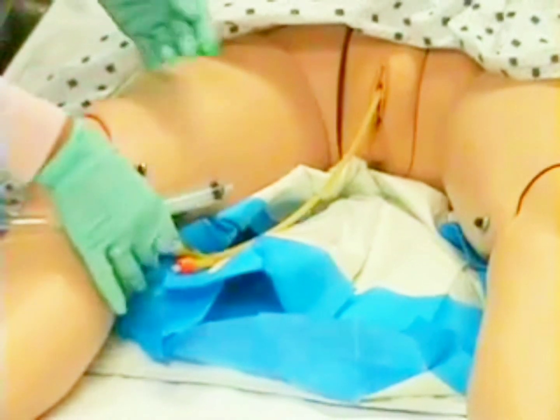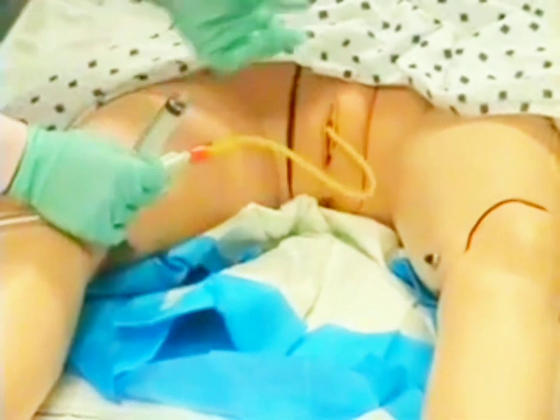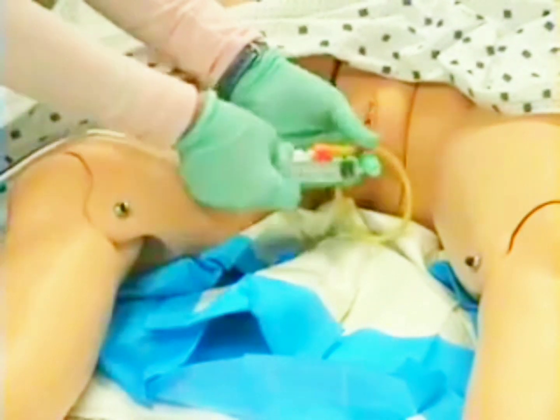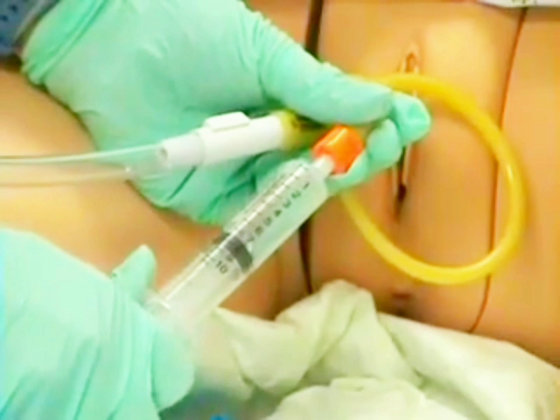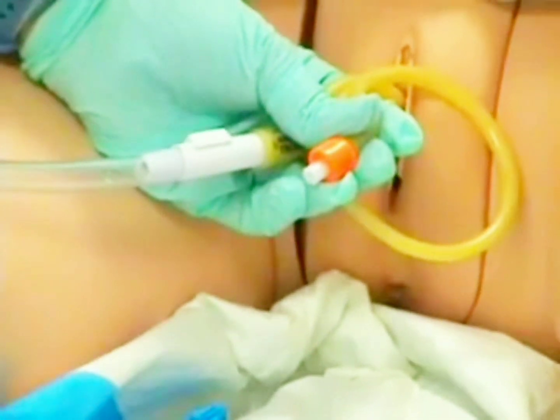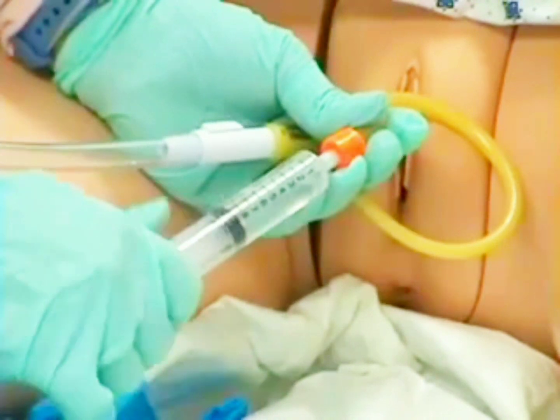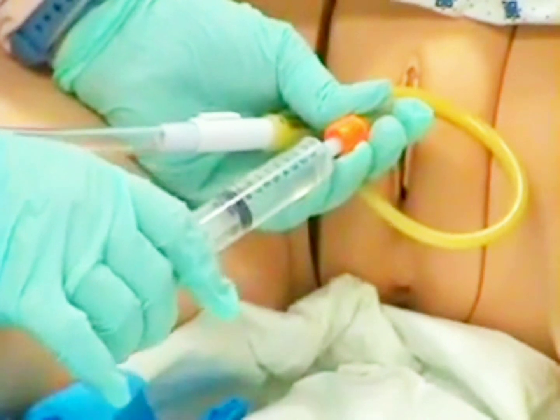I'm now going to deflate the balloon on my Foley catheter. I have my 10 ml syringe and I will attach it to the balloon port of my catheter. With my other hand, I will securely hold my catheter so that when I deflate the balloon, the catheter does not pop out and splatter urine. With a twisting motion, I attach my syringe and it fills with the sterile water. Once it has reached the 10 ml mark, I will remove my syringe, squirt a little bit of the water into the trash, then reattach my syringe to the port and try to remove any remaining sterile water in the balloon. This will ensure that my balloon is completely deflated before I attempt to remove my catheter.